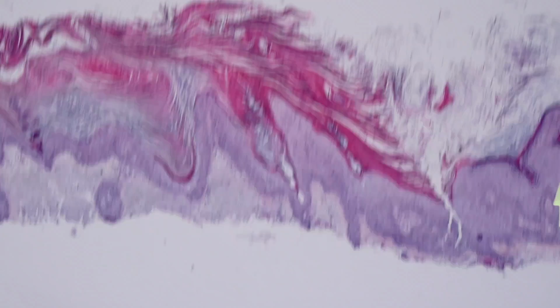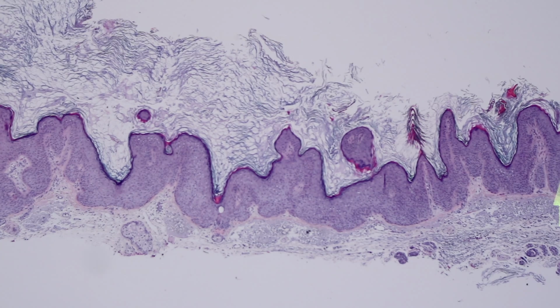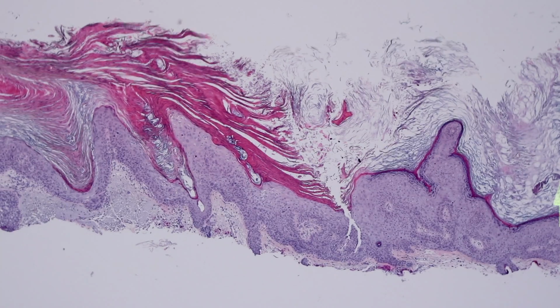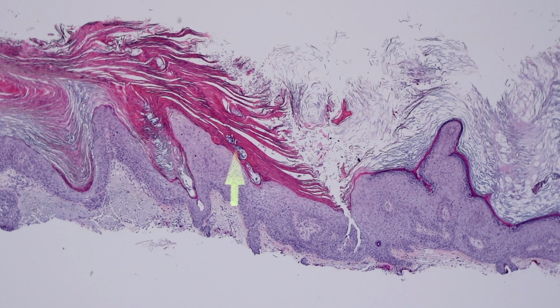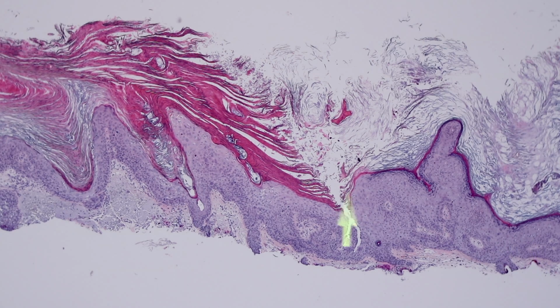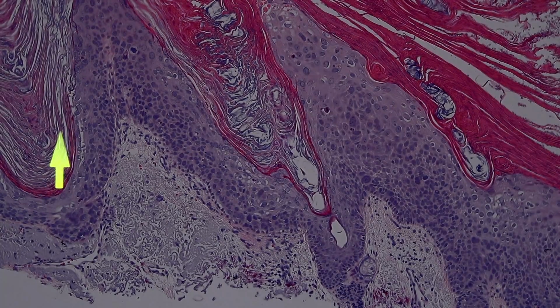Well, okay, that was a fail. I guess it's the next piece. Here's seborrheic keratosis. And then look at that change. Now the corneal layer has gone from this loose flaky to this dense parakeratosis, and you've gone from kind of a less cellular to a much more cellular, hyperchromatic, atypical looking epidermis. And that's because this is a squamous cell carcinoma in situ.